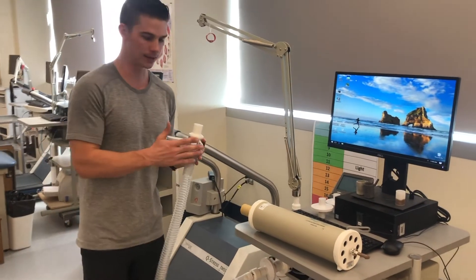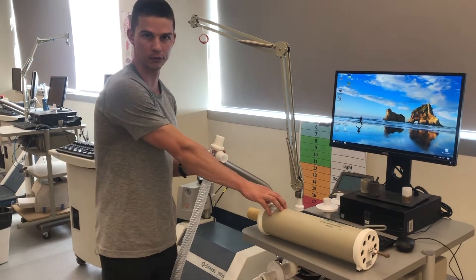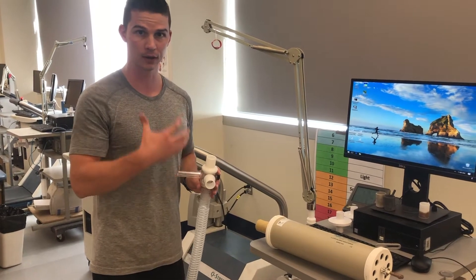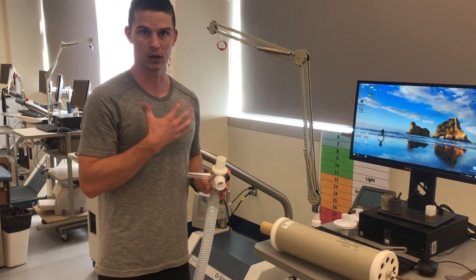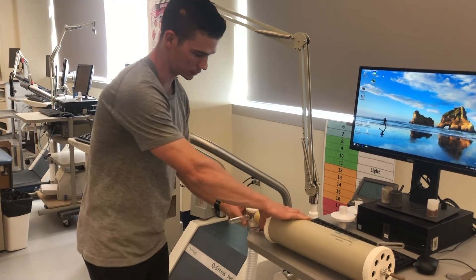We're going to stick the end that the person is breathing on onto our 3-liter syringe, because the 3-liter syringe is supposed to be mimicking the individual's inspiration and expiration. So it goes on just like that.